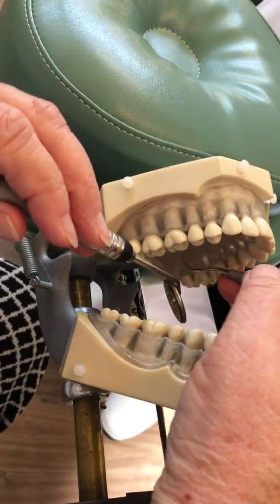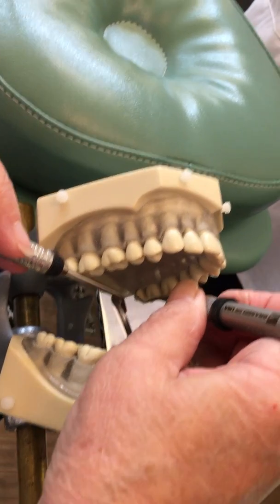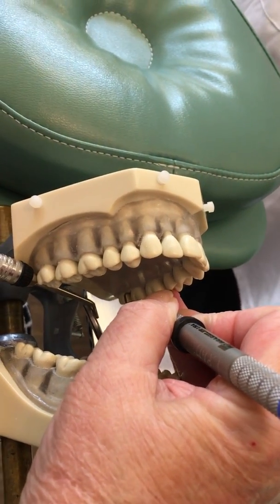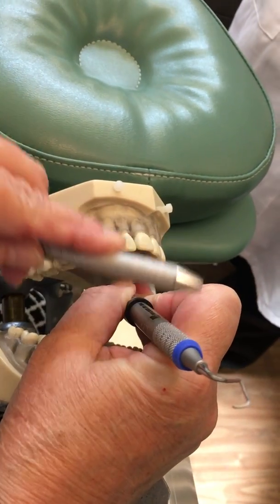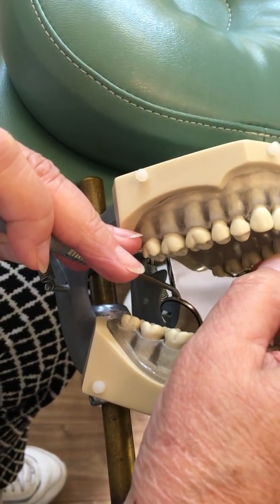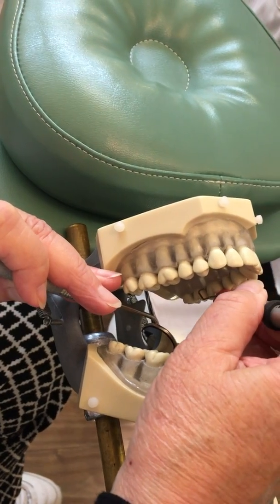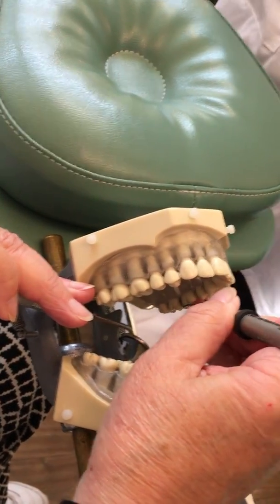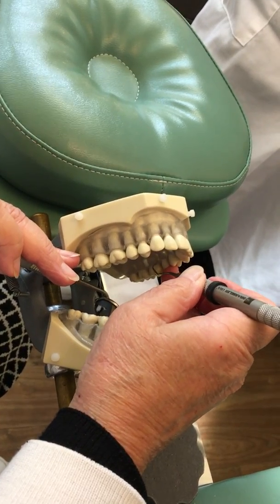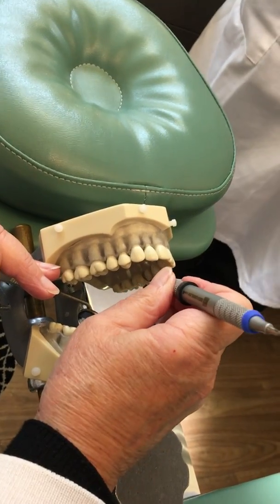For area six, I'm going to move over, stretch my fulcrum up, go in closed and then open. What's a little different here is I'm going to use finger motion. As I come around the corner, I'm going to push my handle back toward this knuckle with my index finger, and that will help get me parallel as I come around the corner. Area six is the only place where finger motion is acceptable, and gravity is wanting to pull my fulcrum off, so I've got to keep it stretched up there.